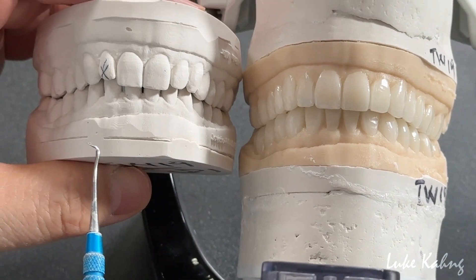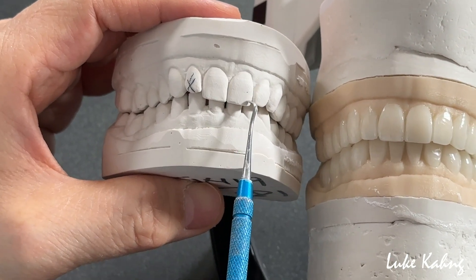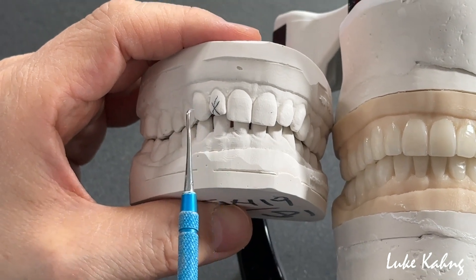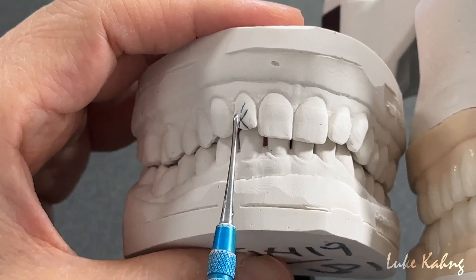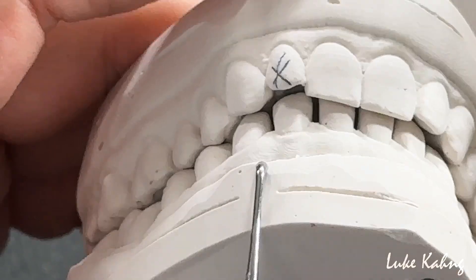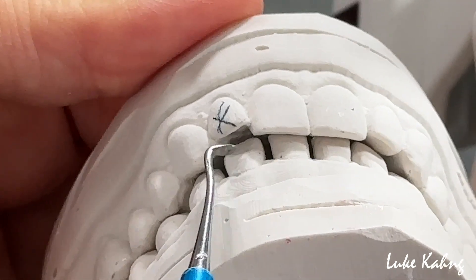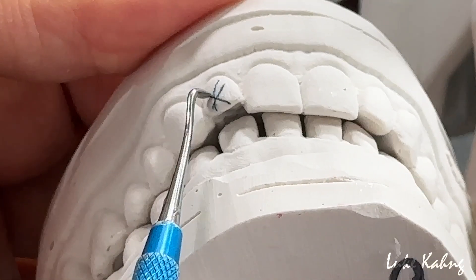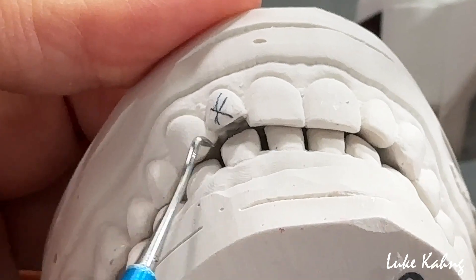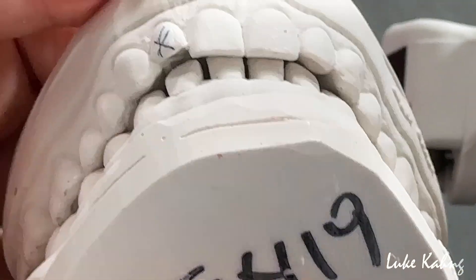This is the pre-op, so we maintain the incisal length from here to there. When I prepped it, my main concern is for the doctor to prep as much as possible here, then I can wrap it around. You can see the open space, so I have to wrap it around — the crown is better instead of the veneer, because we have plenty of room to get the occlusion contact and the lateral guidance, which is what I did.